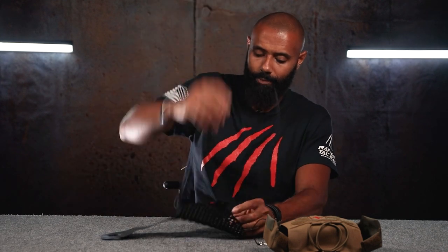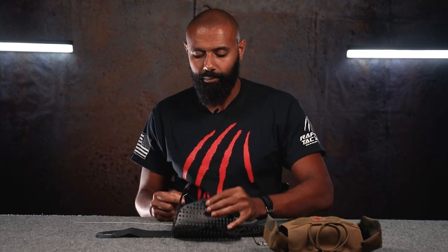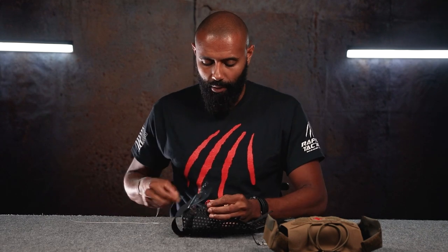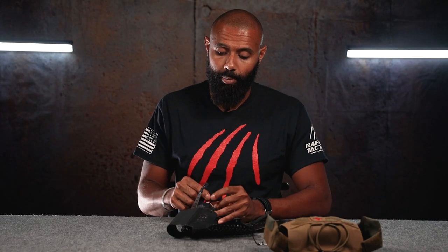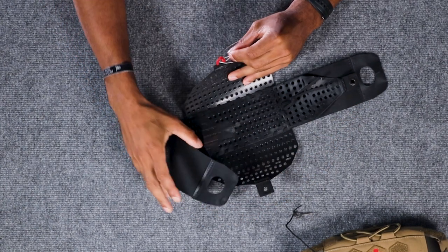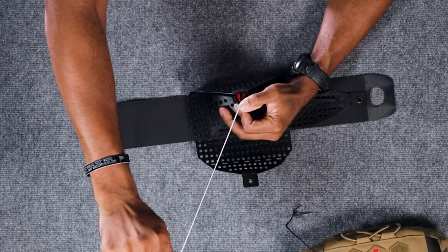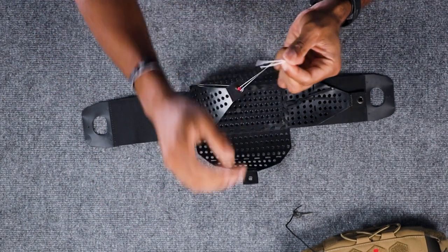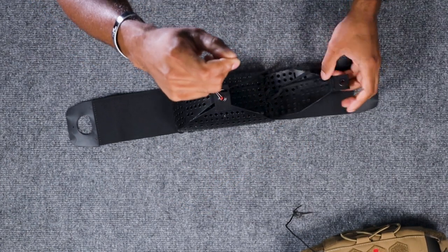Now I'll show you how to put the MIFAC insert together and how to configure it with the pouch. We highly recommend using some kind of string — if you can find some 550 guts, that works really well. What we're doing is taking the little red lanyard and routing the 550 guts through it. This little red loop needs to fit through all of those other little holes. It doesn't matter which order you do this in — just take your guts, loop it through the first one, loop that through the second, and now loop through the final piece.